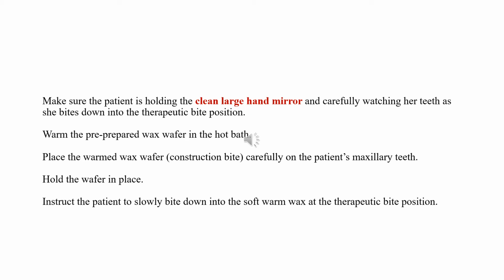So you're going to be working with that patient one-on-one to teach them to bite into that wax correctly at the bite position, not where they want to go, where they have to go, where you've taught them.